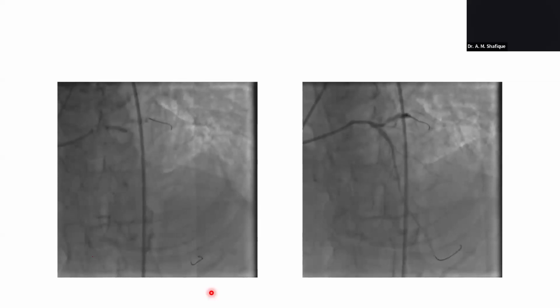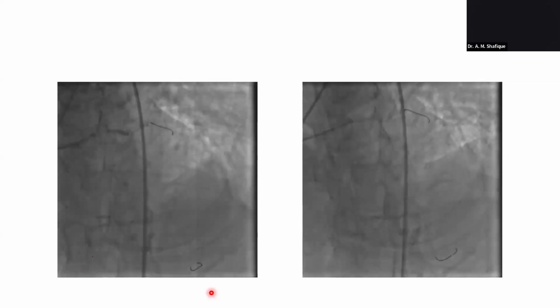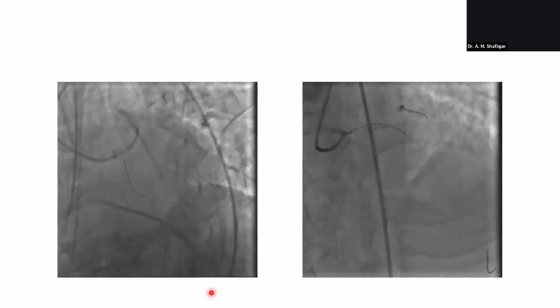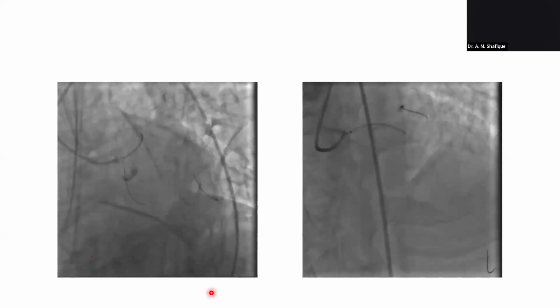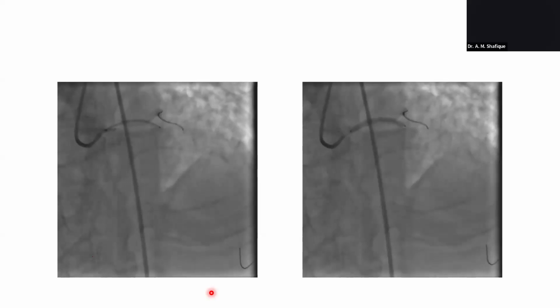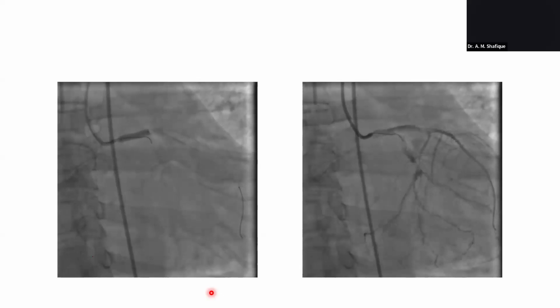We always give breathing time so that there is no cardiac arrest. And Alhamdulillah, there was no cardiac arrest during that period. We placed a stent covering the left main ostium to LAD. Ostium covered and inflated, everything for a few seconds only, and it is quite good.